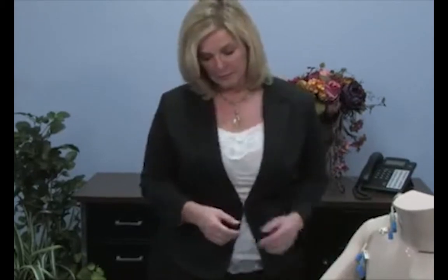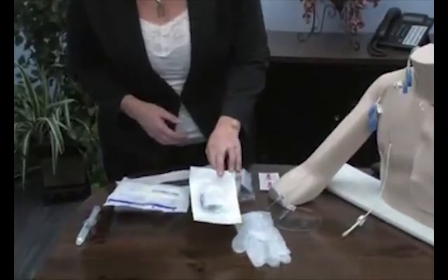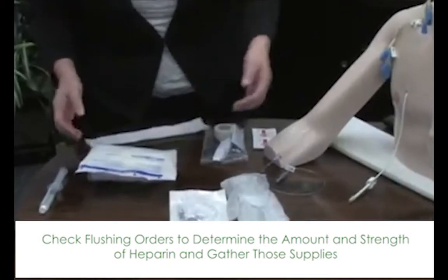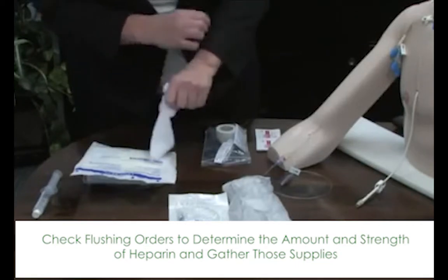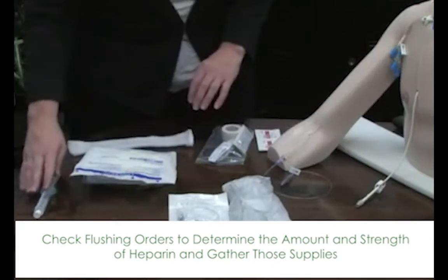So let's get into a supply review. I have my clean gloves, an extension set that has the microclave that we supply you, a dressing change kit. This goes on, helps the patient after everything is said and done, goes on and holds the line secure. Alcohol pads, some saline.